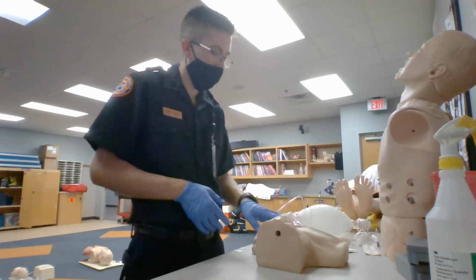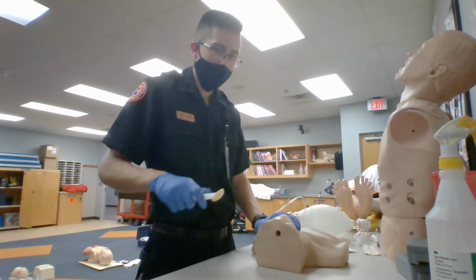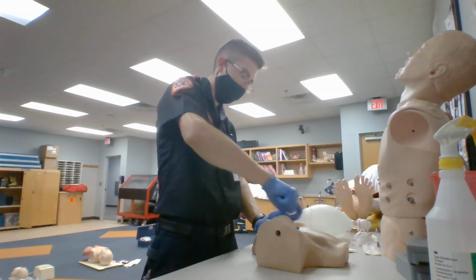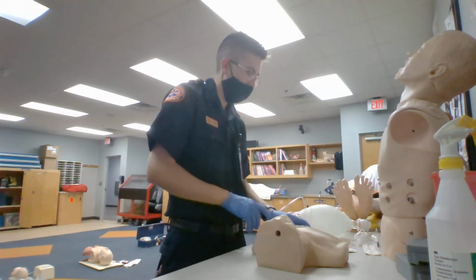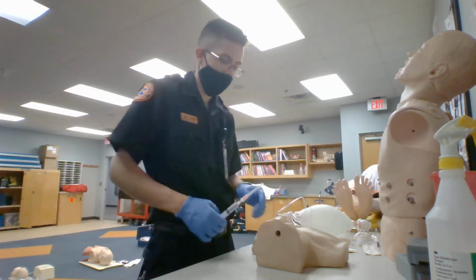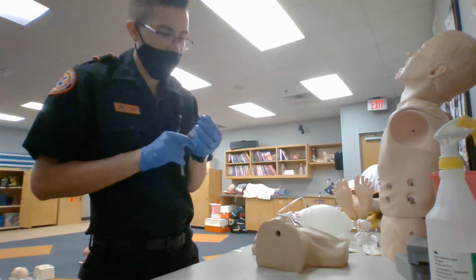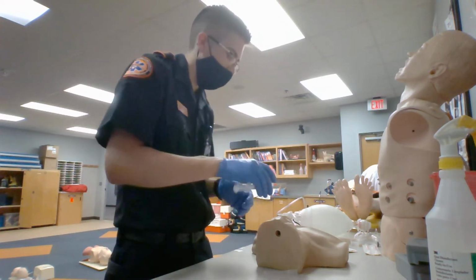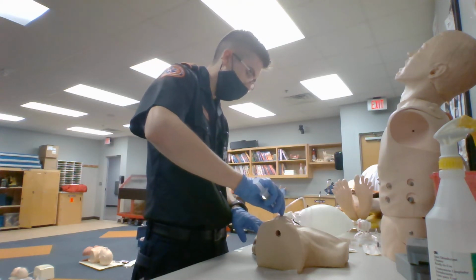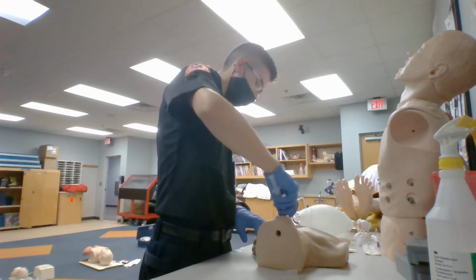So I'm going to come over and find the cricothyroid membrane. Once I find it, I'm going to take my cleaning solution and clean around the cricothyroid membrane. After I have done that, I'm going to remove my needle cap, inspect the IV for any burrs or anything. Once I have done that, I'm going to go at a 45-degree angle, and then I'm going to insert my catheter.